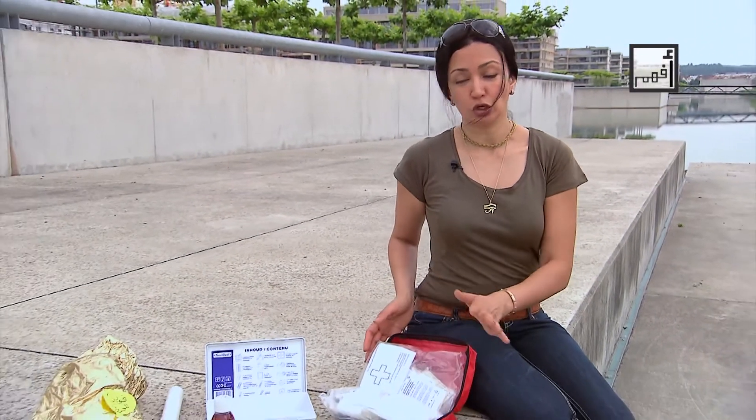A first-aid kit should be available everywhere we go — in the home, in our car, when we go on holiday. We should be fully aware of its content and replace the missing items on a regular basis. In this video, I'll explain more about the contents of a first-aid kit.